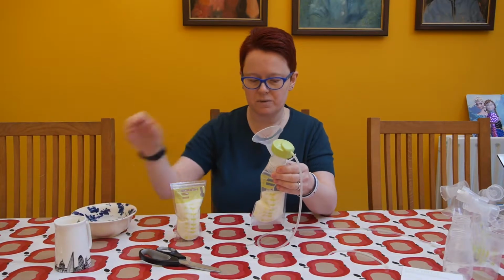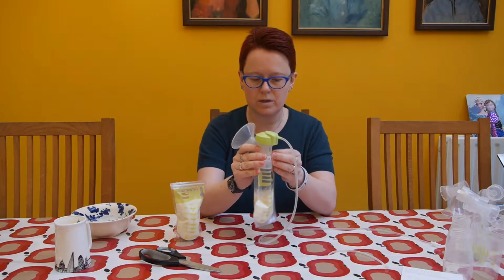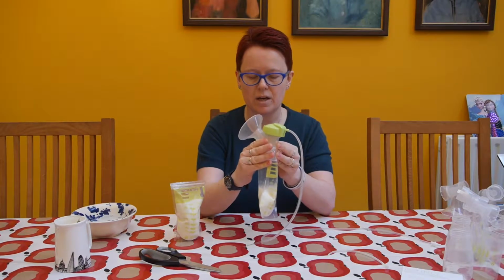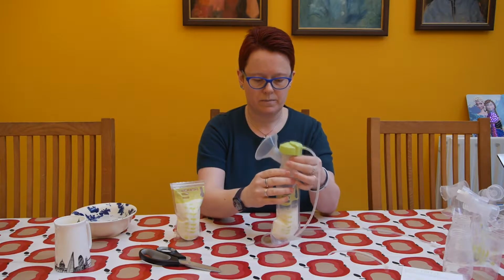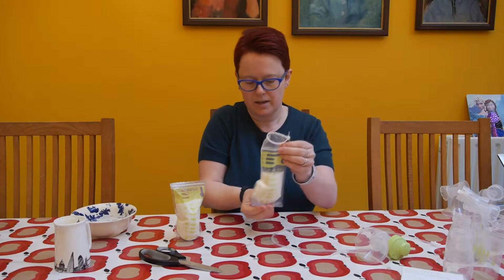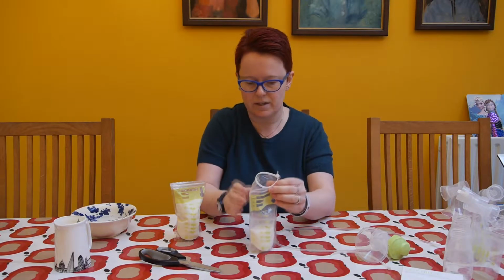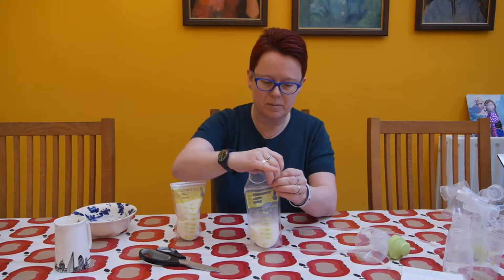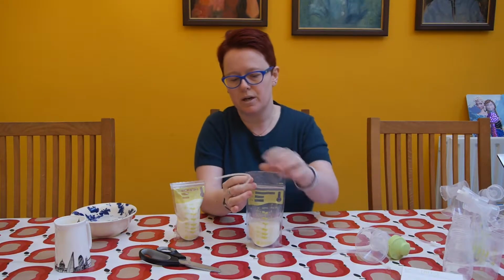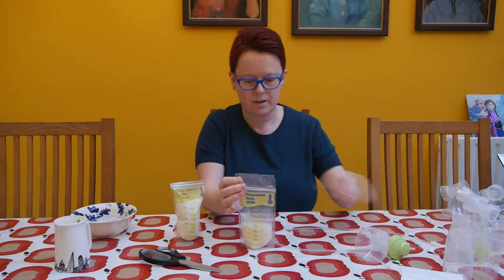Okay, so let's imagine that we finished pumping and now we want to take the bag off and actually store the milk. So I'm going to open the cable tie. We can actually open up the bottom of the bag so it's a little bit sturdier and able to sit on a surface. Now I can actually rip off the cable tie at this point because we don't need to keep those pre-cut holes anymore, but we're going to use that cable tie again, so don't get rid of that.